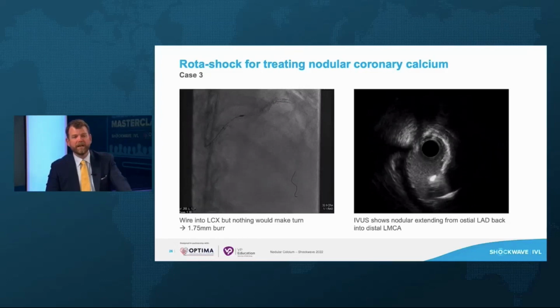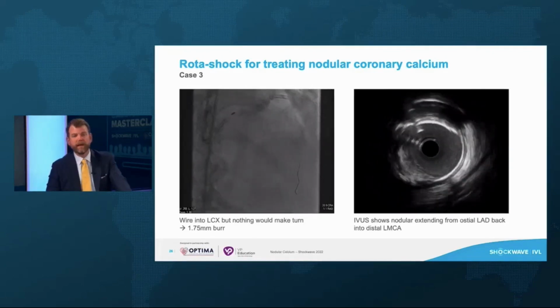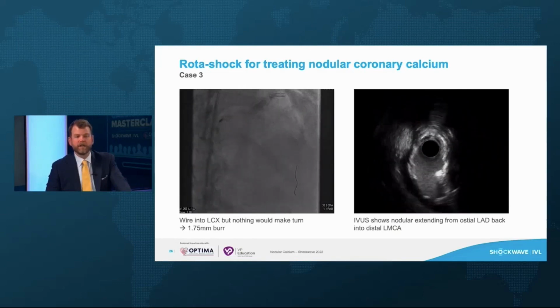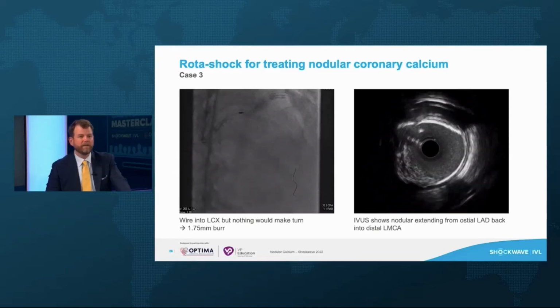And of course, there's a huge nodule that protrudes. And even after atherectomy, big nodule, which again just illustrates how atherectomy unfortunately does not necessarily change the characteristics of the nodule that's going to allow us to get a good MSA and stent result.